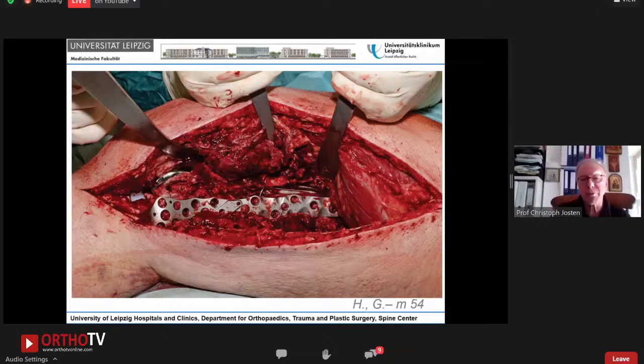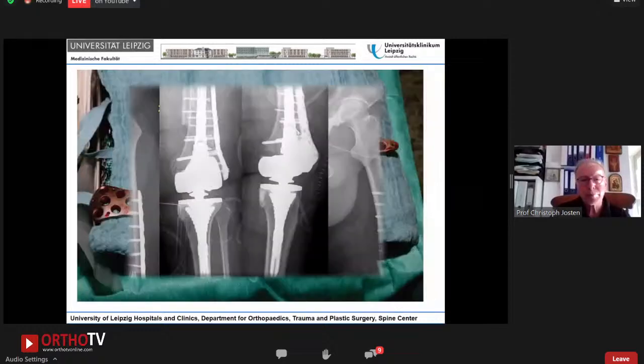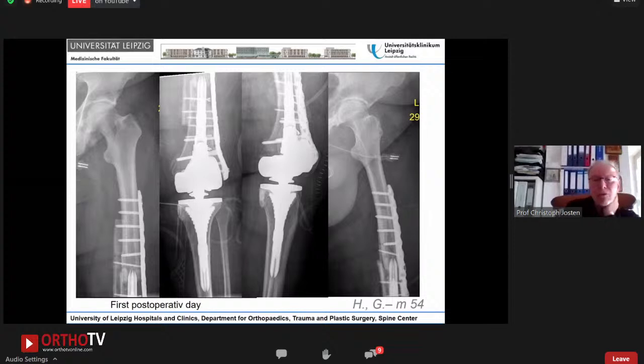This is the intraoperative picture. You see, not any more minimally invasive. We made another solution, and I'm more and more doing this. Instead of a medial plating, I used a medial strut graft. This stays according to my philosophy, a rigid fixation.